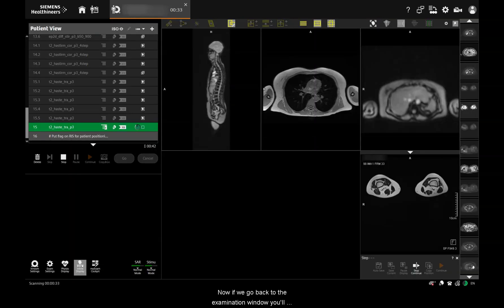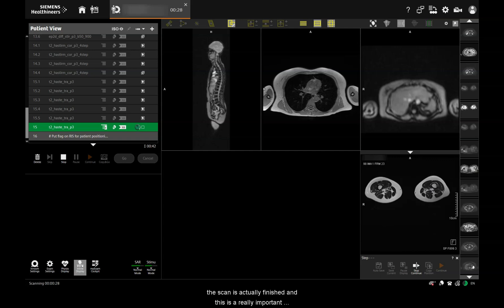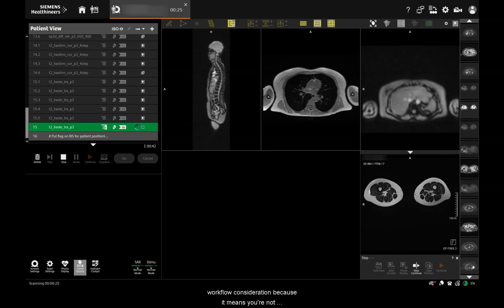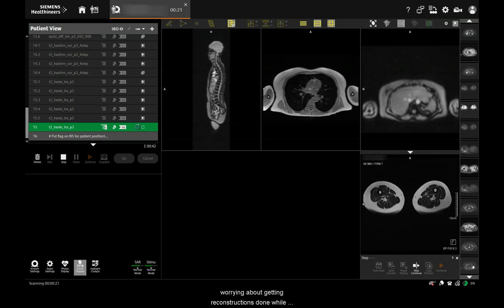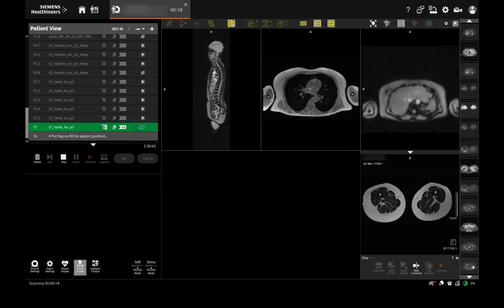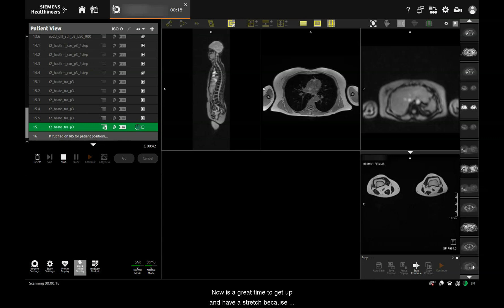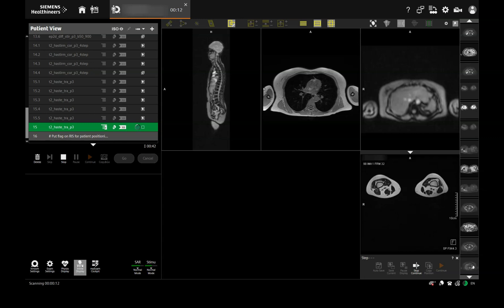Going back to the examination window, you'll see that we've completed all the post-processing before the scan is actually finished. This is a really important workflow consideration because it means you're not worrying about getting reconstructions done while trying to get the next patient in for their scan. Now's a great time to get up and have a stretch because you've been quite busy over the last 40 minutes.